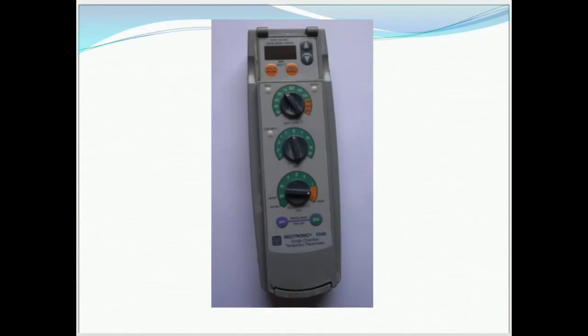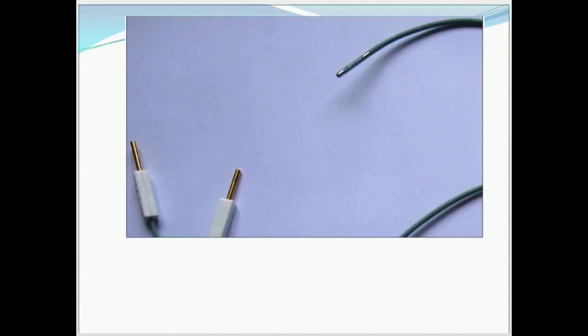This image shows a Medtronic single chamber pacemaker with a rapid pacing feature on the top of the generator. This image shows a typical pacing wire with both ends. This is the connecting end with the distal and proximal connecting ports, and the catheter tip of a bipolar wire.